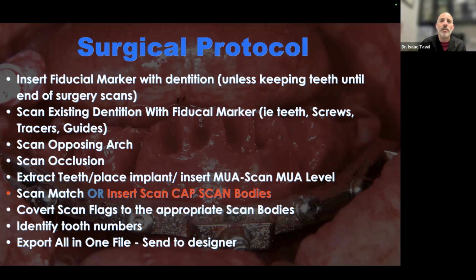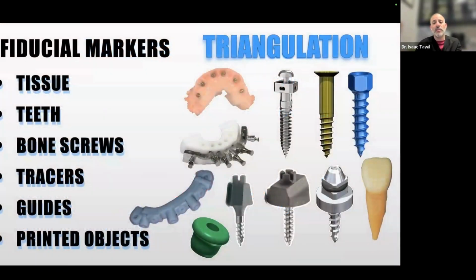And hopefully I get a 1-hour turnaround design, and I can print in my office very quickly and give my patient a same-day provisional. These are some of the fiducial markers that I use. If I can keep a tooth till the end of surgery, it's great.